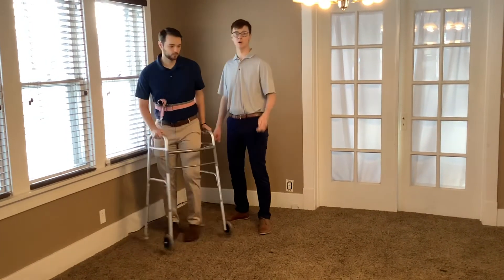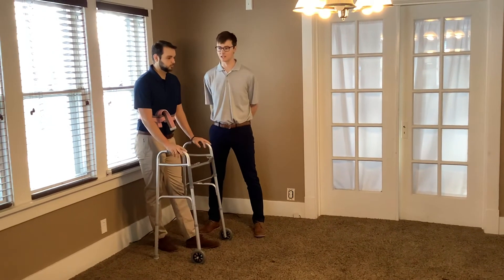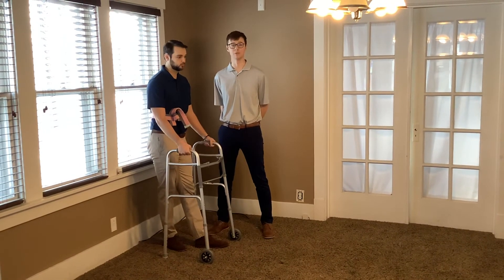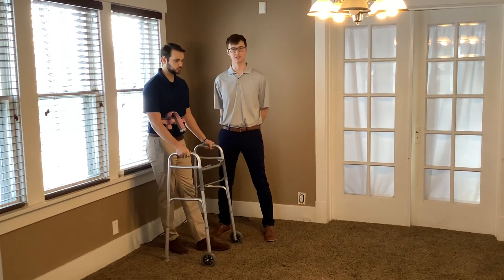A time to use a walker over crutches is when we want more stability with the patient. They can be used in any population where you need more safety and stability — for example, an older population, whereas a younger, more active population could be using crutches.